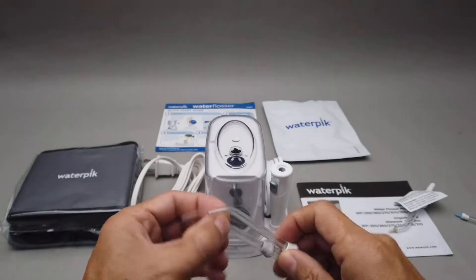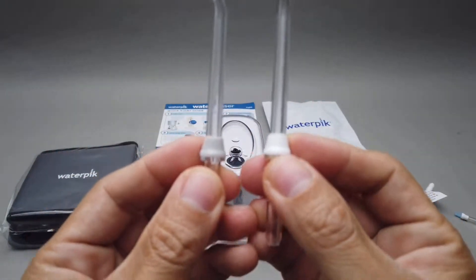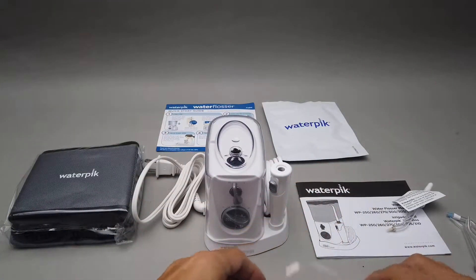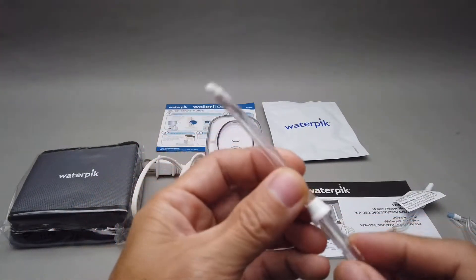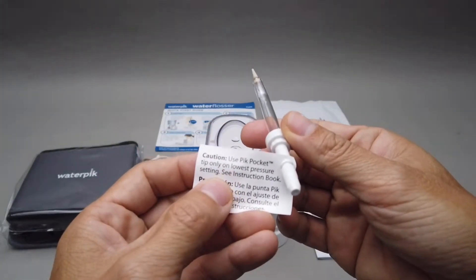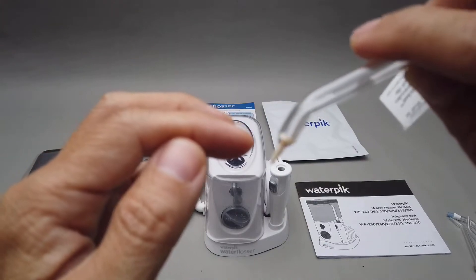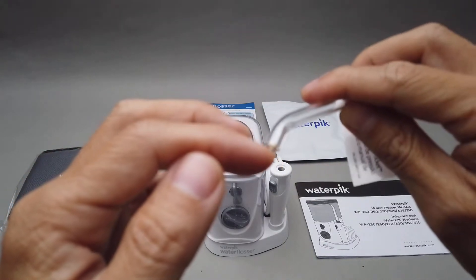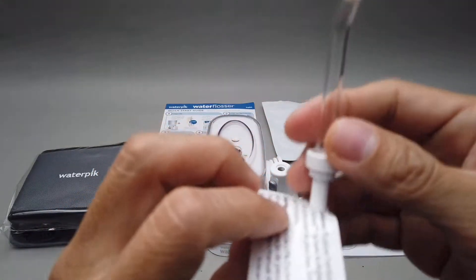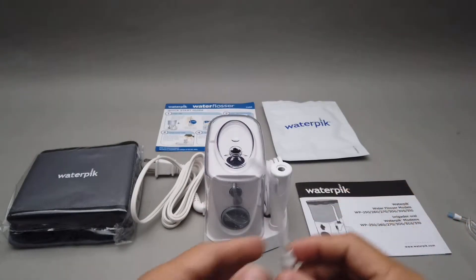Then two classic ones — normal ones that just spray water out. You got a different color scheme so you can distinguish between whose is whose. There's also a special nozzle I didn't fully read, and then one with a caution: use pocket tip only on low pressure. I think this one goes in between your gum line and teeth to scrape gunk out of that gap, so they're telling you use low pressure — don't damage your gums.